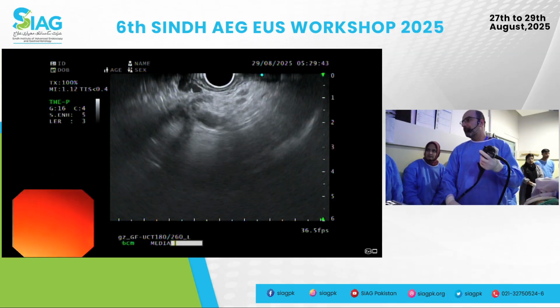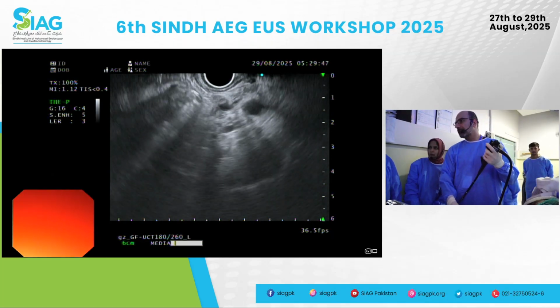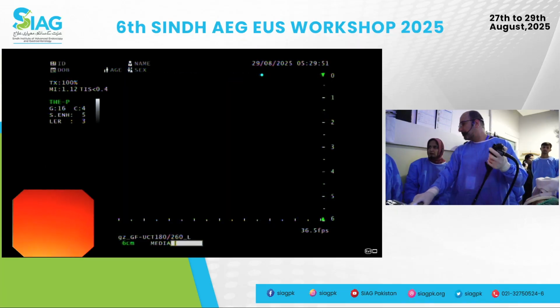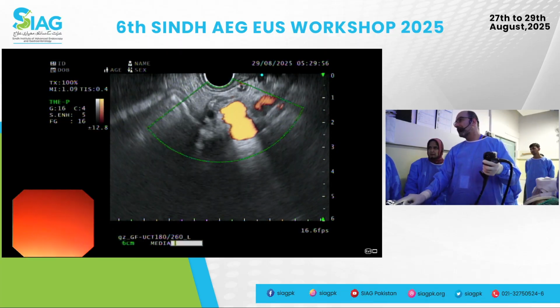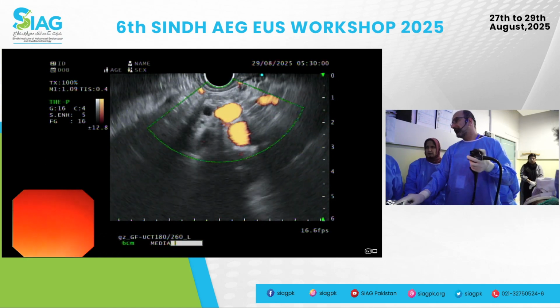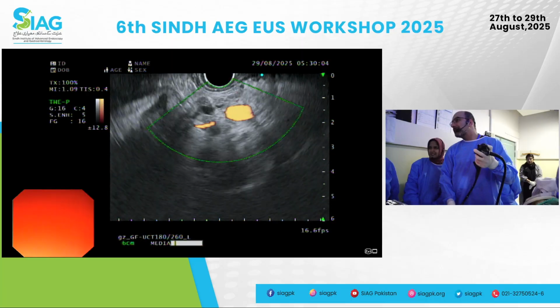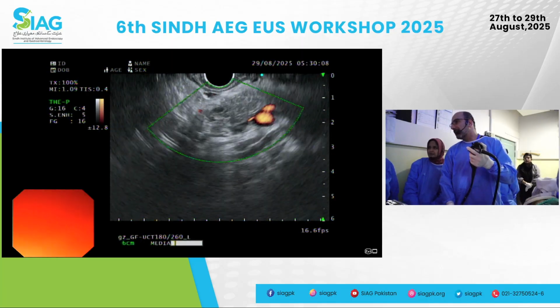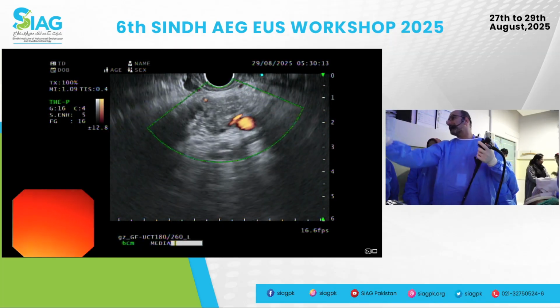We would expect to see the splenic vein above or below the splenic artery? Above the pancreas. What's closer, artery or vein? Vein is closer, and artery is farther. Yes, so you would expect to see the vein here. You see this big vessel, but you see a smaller vessel underneath. You don't see those two classic vessels, right?